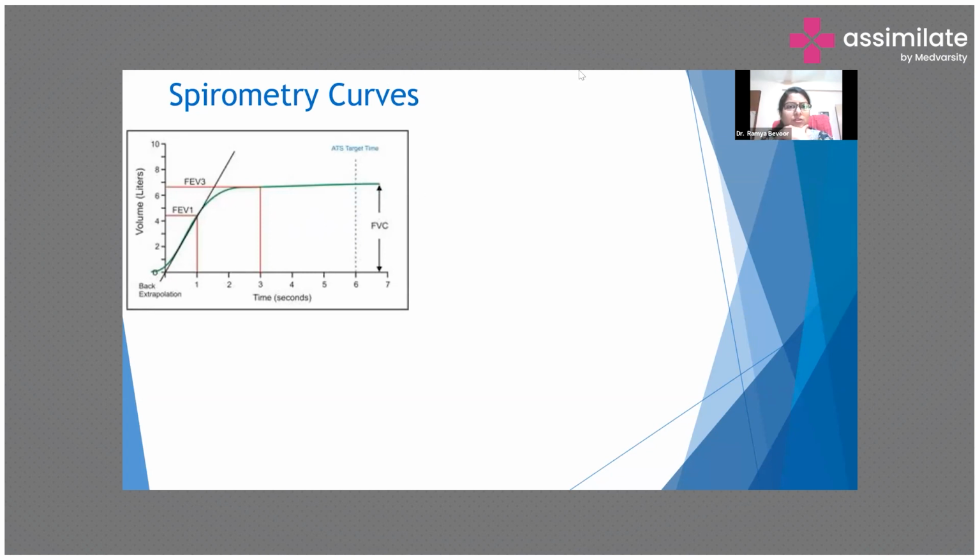Maybe I can just spotlight. Yes, if we look at this, this entire thing is the forced vital capacity. Then we have the FEV1 here, which is the air that moves in the first second. And then by the third second, it reaches a plateau. So this is what happens here. So this is a normal curve.